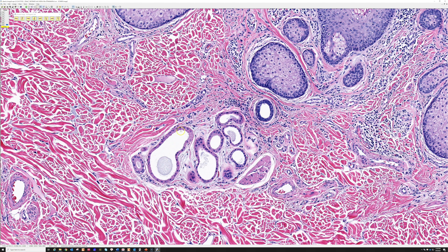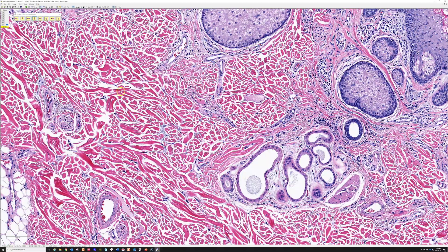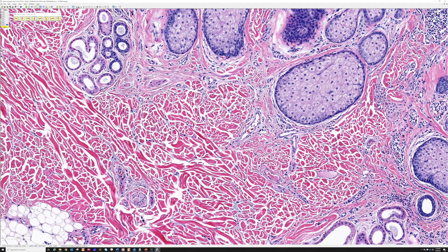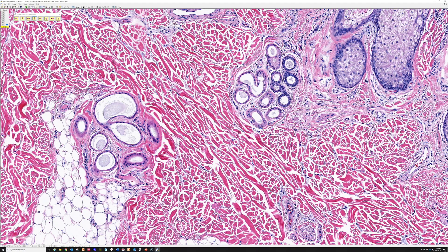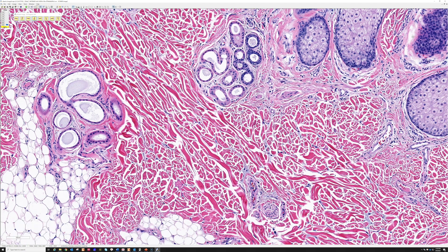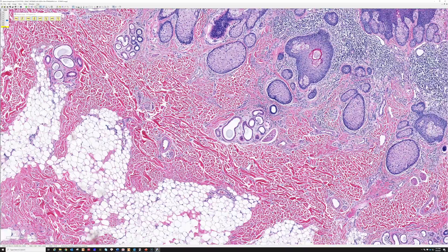Eccrine glands normally look a little more like this. These actually have very abundant pink, grainy cytoplasm and large round nuclei — these look like apocrine glands. They kind of look apocrine, but they also kind of look eccrine, so people have called these apo-eccrine glands. They're basically like eccrine coils but have some apocrine cytology — it's a very characteristic finding.